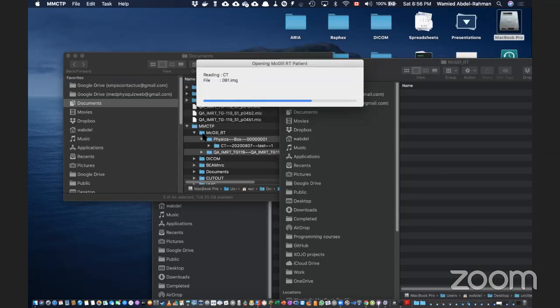It can also work with different modalities like gamma knife and tomotherapy. It does have that, though I haven't done it. When the Linac that I see there, gamma knife, I'm not sure. It has CyberKnife. Okay. It has Elekta. It has Tomo, and the list.